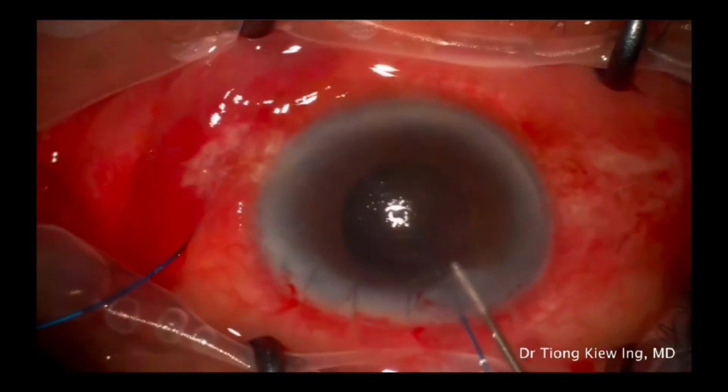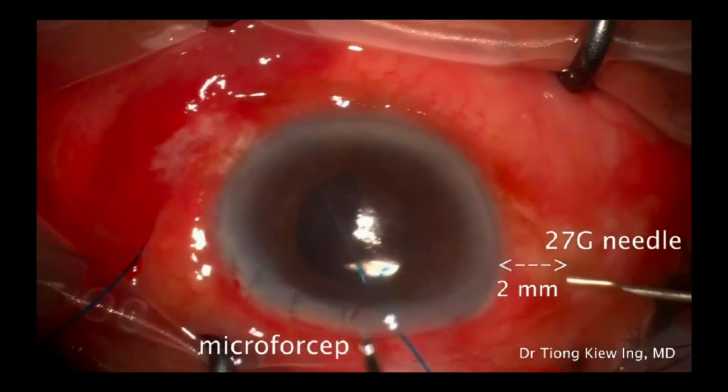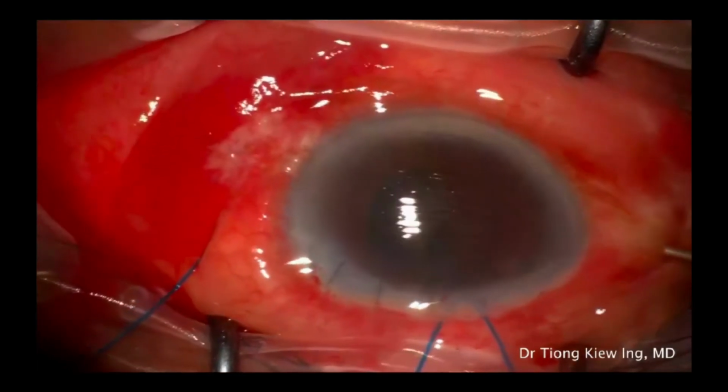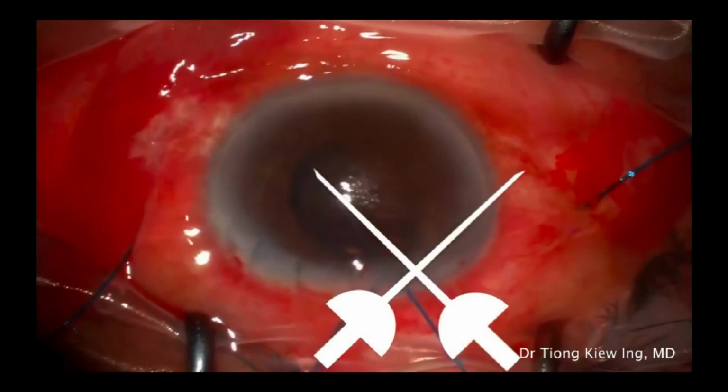OVD is further injected into the anterior chamber to keep the eye firm. Second sclerotomy is performed in the opposite side with similar method with much more ease after filling in adequate OVD. Here comes the beautiful fencing duel in the eye.